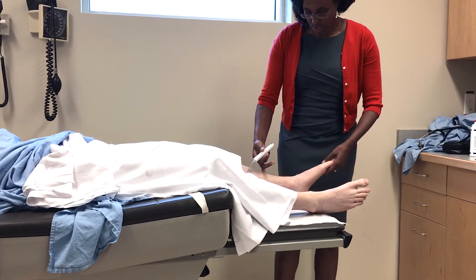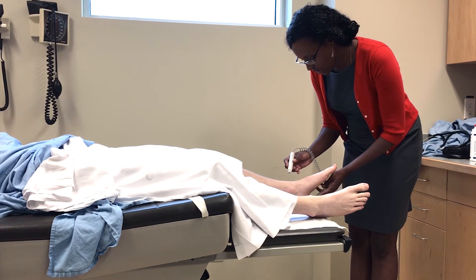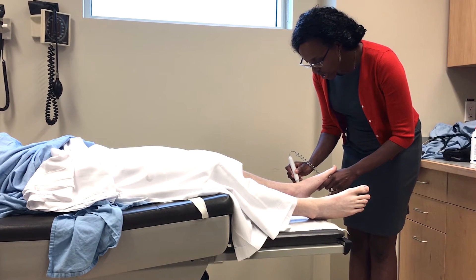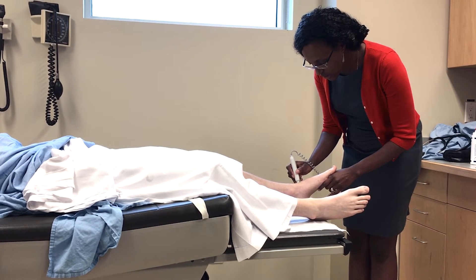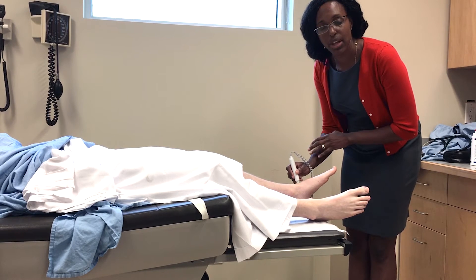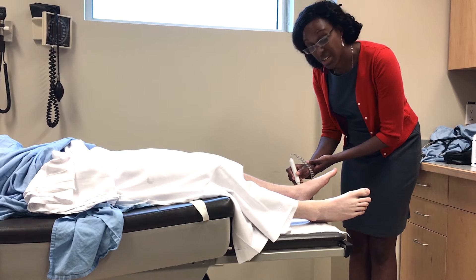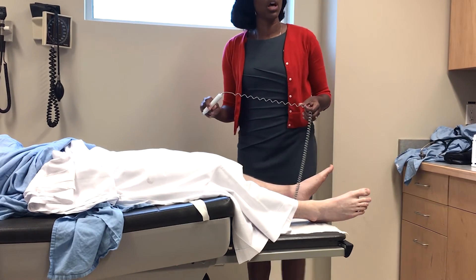For the purposes of the camera I will rotate the limb, but you can have the patient in their most comfortable position. Students often want to examine the dorsalis pedis at the most distal portion, but really its signal is best heard around the level of the ankle on the dorsum of the foot. Again, 60 degrees, and wait until you hear it at its fullest portion. You want to use something to stabilize your hand so that it doesn't move — I just place my fifth finger on the patient's foot, but you can also hold your wrist to minimize any small movements. And that is the examination of the lower extremity.